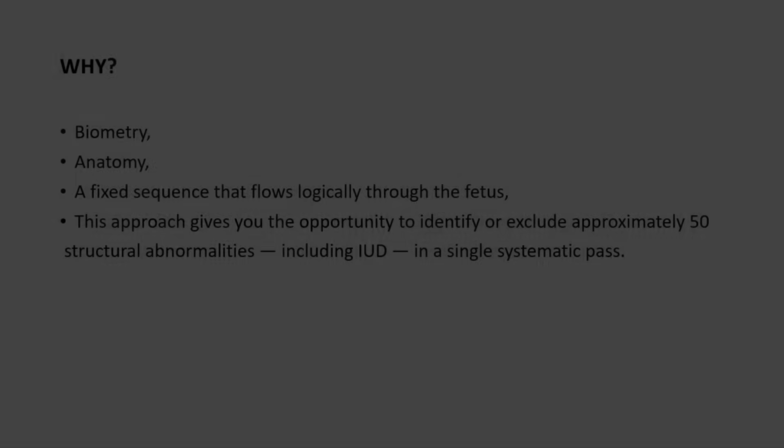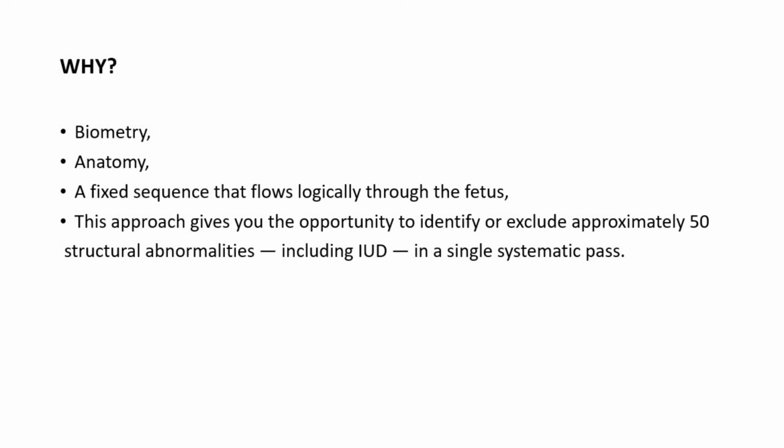Let's go. Why a structured approach? The mid-trimester scan has 2 jobs. First, biometry, measuring the fetus to confirm dates and growth. Second, anatomy, reviewing every major organ system to exclude structural abnormalities. Most sonographers can do biometry in their sleep. Anatomy is harder because there's no built-in order. Without a system, you'll revisit the same structures, skip others, and finish the scan unsure whether you've been thorough.